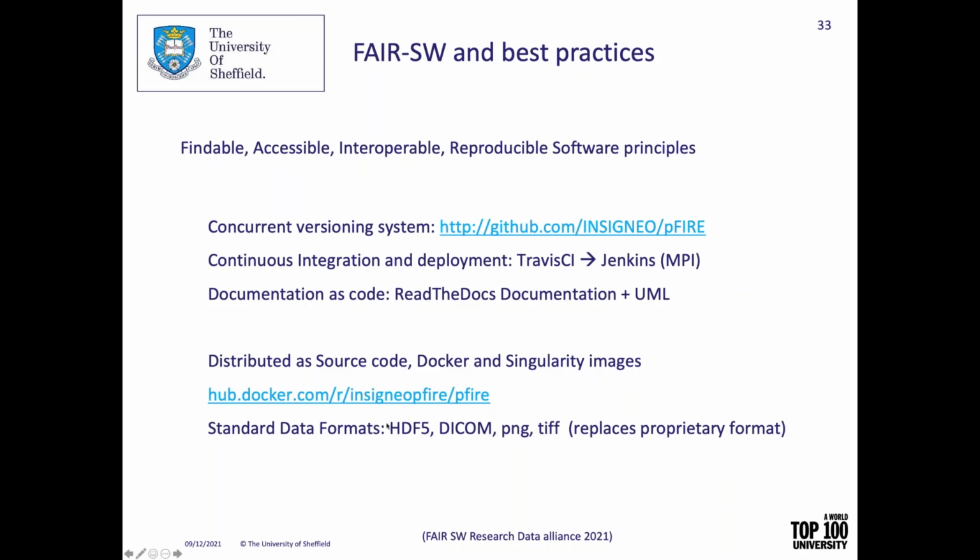We strive to use only standard formats. So for the images, we basically use DICOM, but some of the images we can also process as PNG, TIFF, and HDF5 for the registration data and the images as well.